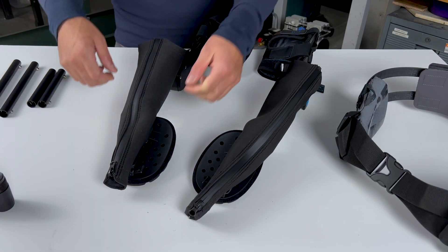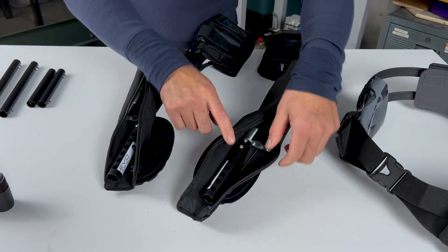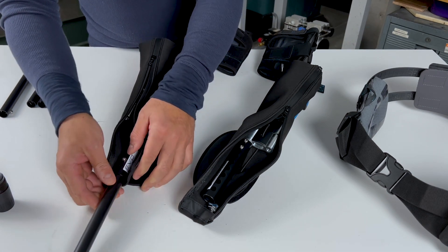To assemble the device, start by unzipping the knee-spring cover to reveal the upper torso tubes. Insert the correct size lower torso tube into the upper tube and slide them to the settings suggested in the operator manual.